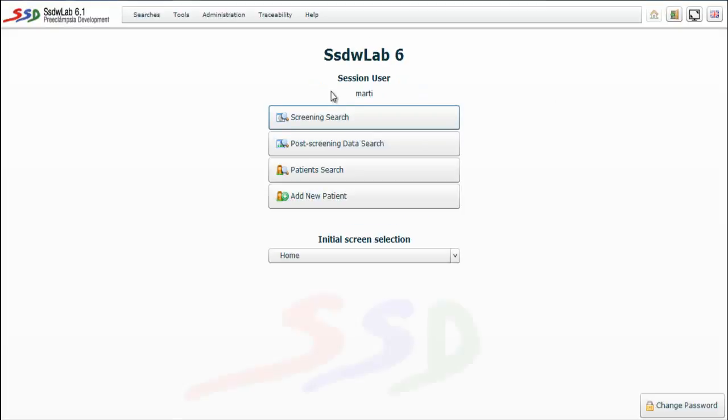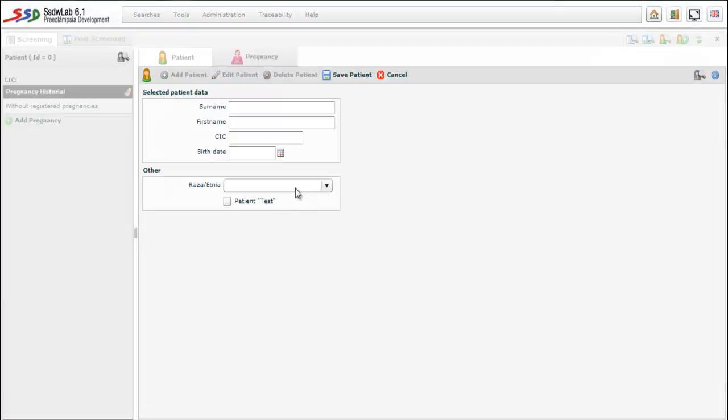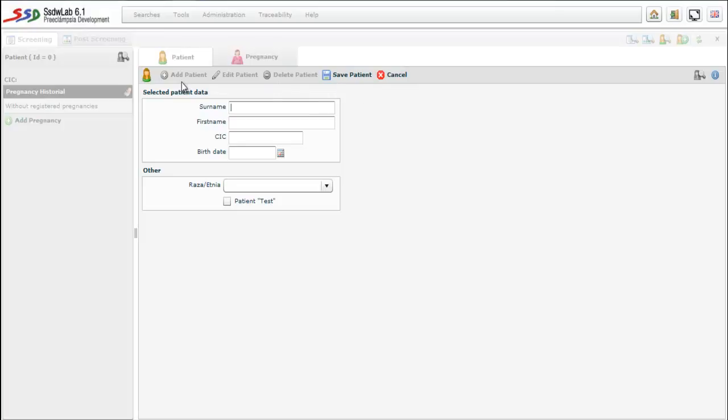It will appear several options and we choose add new patient. The first folder is patients folder. We can observe an edit bar just below the tabs of the folders that allow us to add, edit, delete, save, and cancel. These buttons appear on all folders as we will see.